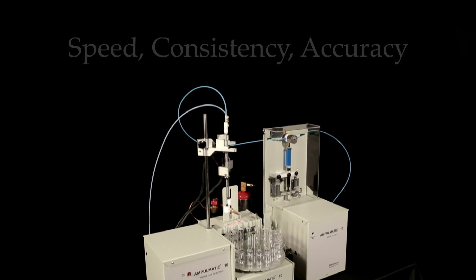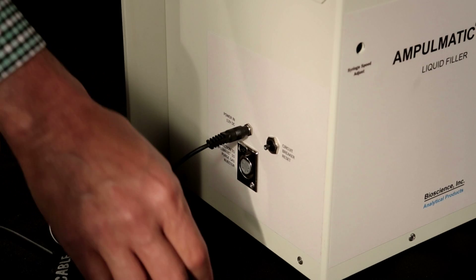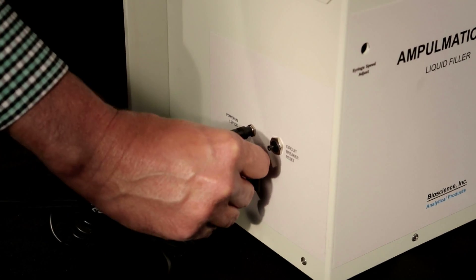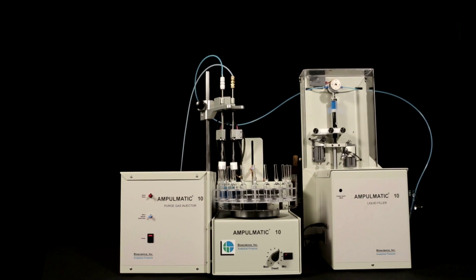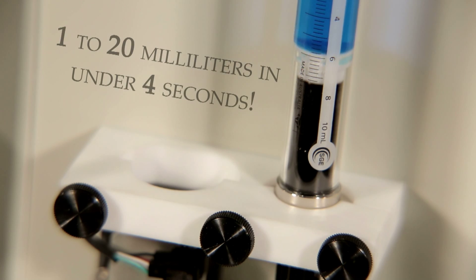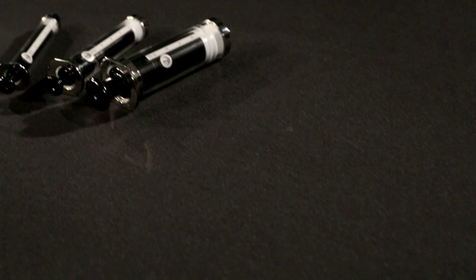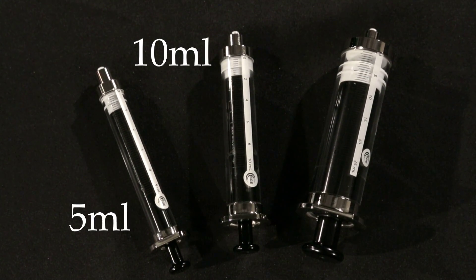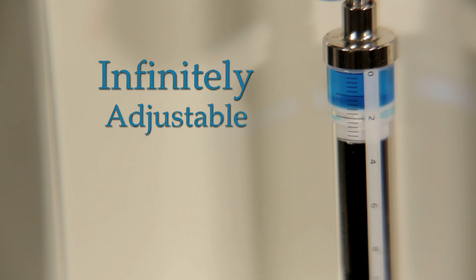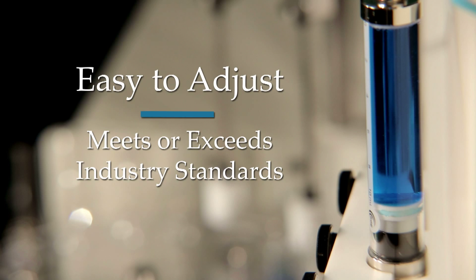All timing with the base unit is controlled automatically. The liquid filler module is capable of filling ampules from 1 to 20 milliliters in under 4 seconds. The process starts with the selection from three easy-to-chain syringe sizes: 5 milliliters, 10 milliliters, and 25 milliliters. The injection volume is infinitely adjustable and stable, easy to adjust, and meets or exceeds the industry standard for long-term accuracy.